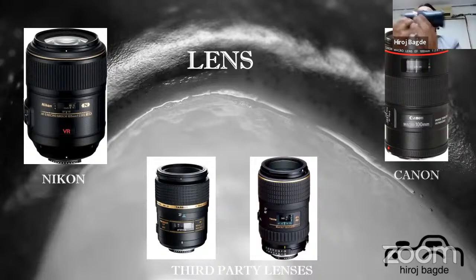So I'll come to the lens costs. Lenses for Nikon range from 55 to 65,000 rupees. Canon costs around 35 to 45,000, and the third-party lenses start from 20 to 25,000 rupees. So that's why they're cheaper, and they have the same capability of 1:1 ratio. But some disadvantages are they cannot be relied upon as much. So Nikon will prefer a Nikon camera, Nikon lens.